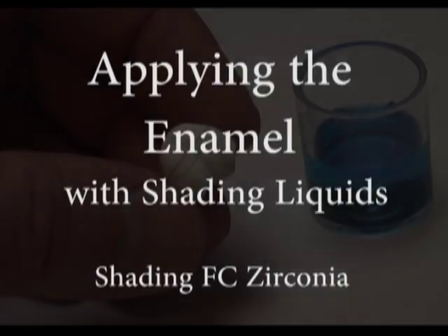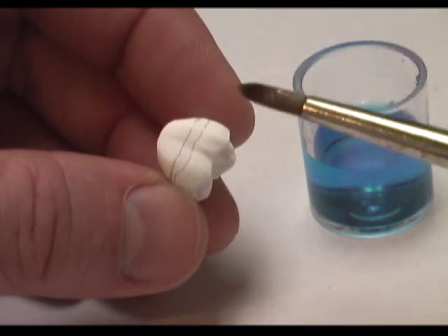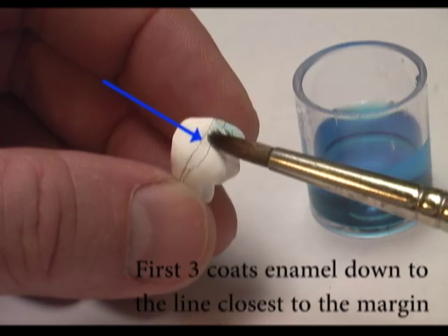Now we're going to demonstrate how we apply the enamels and the dentin liquids. First we start with the enamel, and we're going to take the first layer of liquid down to the line closest to the margin.